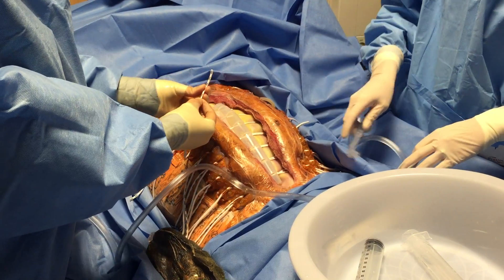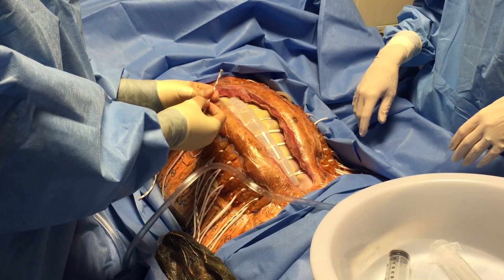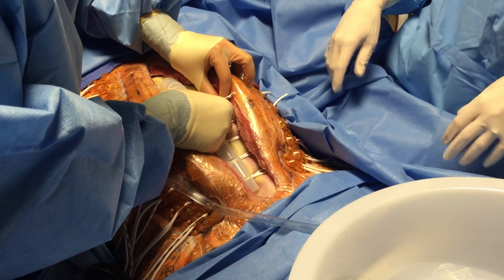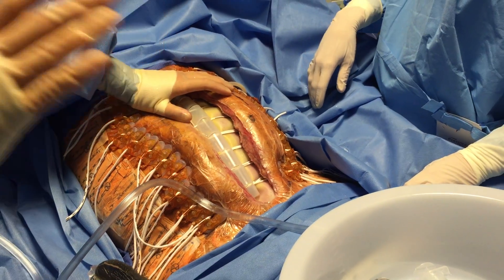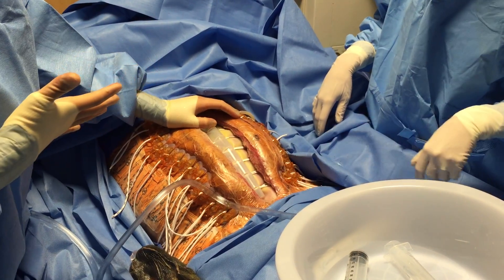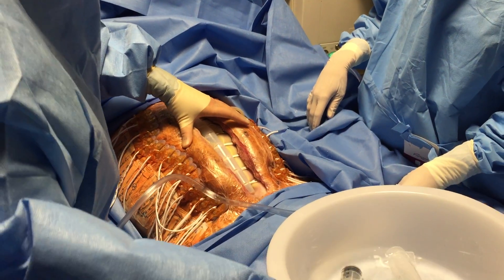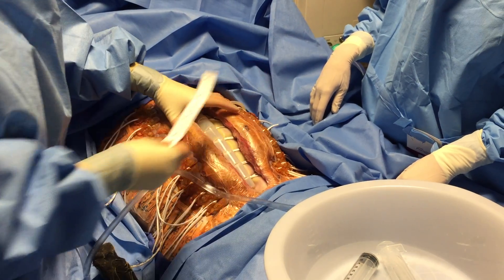I'm going to take my elastomers. You can see the hash marks on them — when they are extended to two times the normal length, that is the correct tension you need. Right now we're right at two times the normal length here, but up here it looks more like one and a half times. Don't be discouraged if you come back 48 hours later and you're still at two times — you're going to have stalling, and that's a normal process. This has been on for two and a half weeks. We started at 26 centimeters and now we're at six. I'd say that's pretty successful.